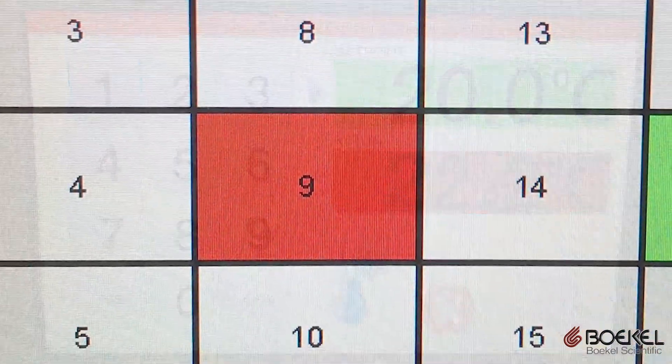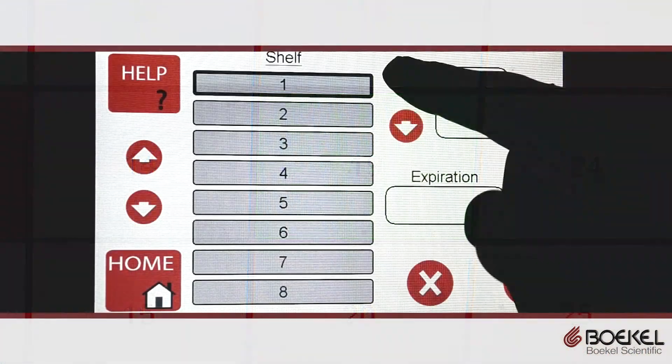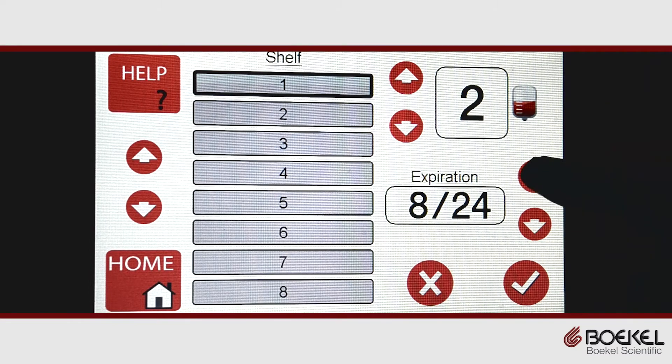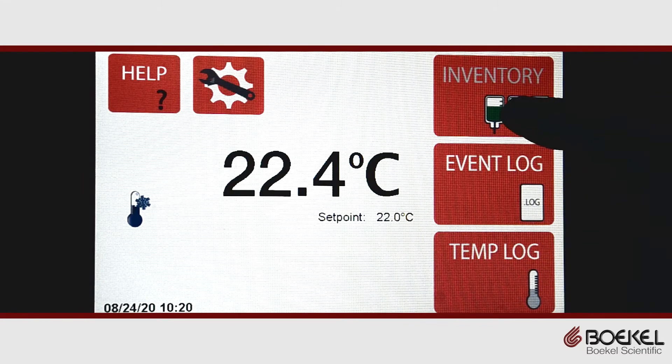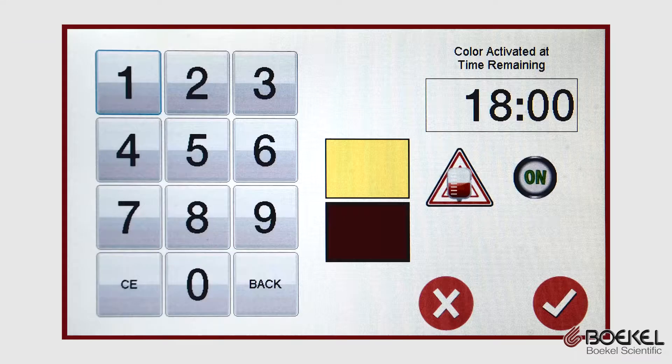The unit has a patented inventory management system that actively tracks the expiration of platelets based on their location. To use this function, the operator enters the expiration date and places the platelets on the selected shelf. The unit will then show a color-coded image indicating what platelets are at risk of expiring, and this can also be used as an alarm to alert operators to a possible expiration.